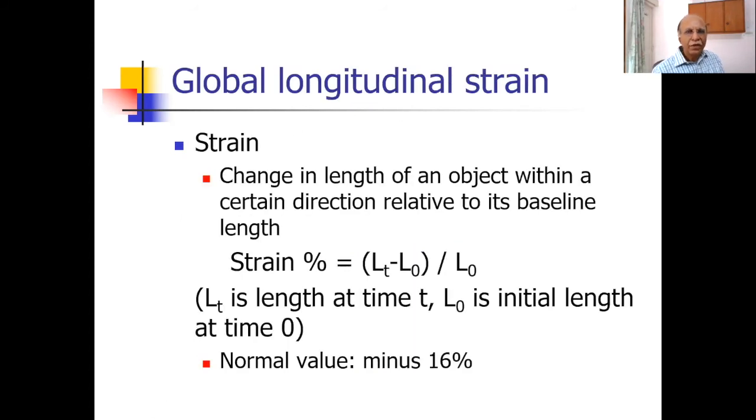Global longitudinal strain is another method, which is again a very sensitive and early marker of LV systolic dysfunction.